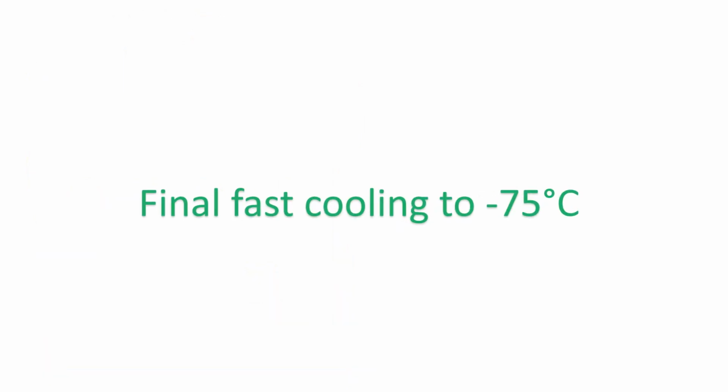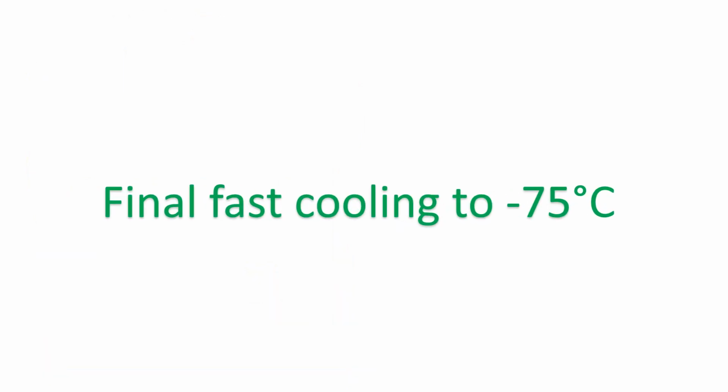If no collateral damage is detected, further faster cooling, typically to minus 75 degrees centigrade for up to 480 seconds, produces a permanent treatment effect. Though the chance for collateral damage is less, the efficacy also may be a little lower than radiofrequency catheter ablation because of the slightly higher chance for recurrence.